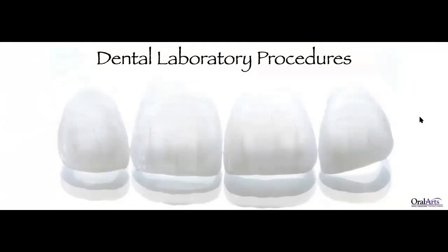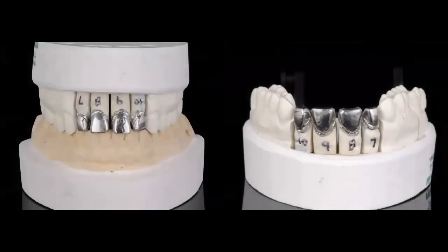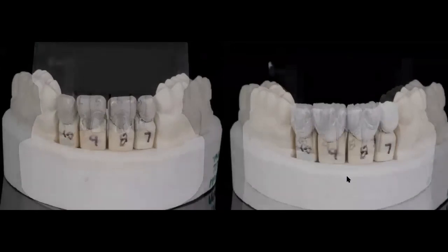And that's what I like about feldspathic porcelain. If they are managed well and they are thin enough, the way that the light is transmitted is unparalleled, is unmatched. In my mind, in my hands, this is what I like the most out of this material. But at the same time, look at the way that he recreated craze lines. Look at the texture. Look at the perikymata on the gingival and middle thirds. All that artistry just done by this ceramist's hands. And these are just some photos that they shared with me just so that you can see the technique, very technique sensitive, using feldspathic veneers.